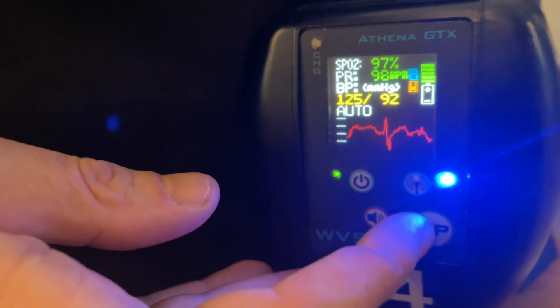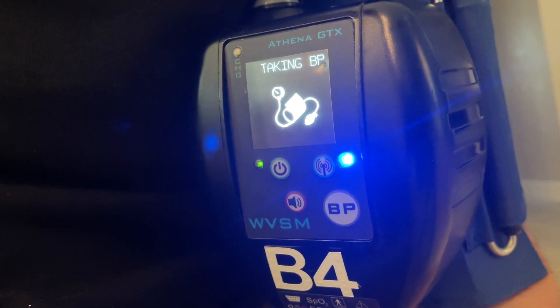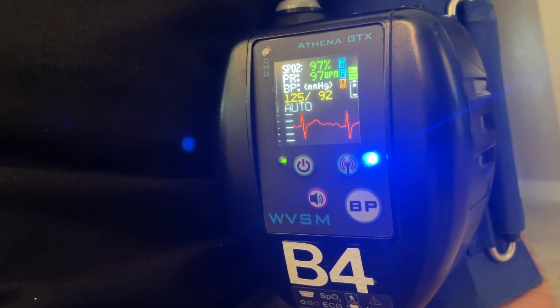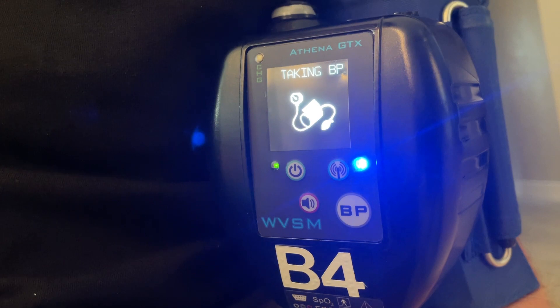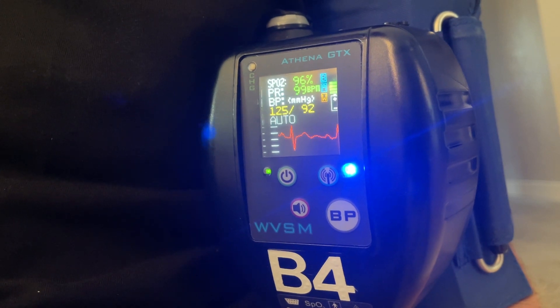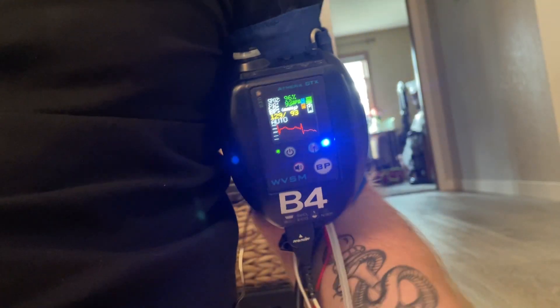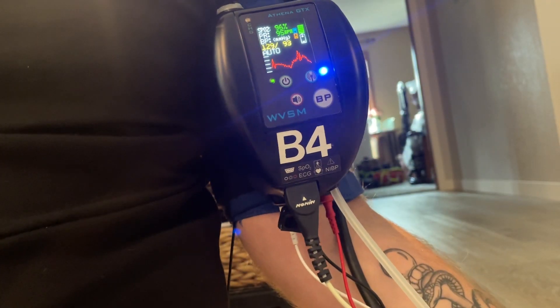I'll push the BP button for a little cycle of blood pressure. The big advantage to this device is really that it can be connected by Velcro to the blood pressure cuff, and allow your patient to move around — or be moved around — without having to remove all the vital signs monitoring. As you can see, it's actually attached by Velcro to the blood pressure cuff, making it a really compact package for patient movements.